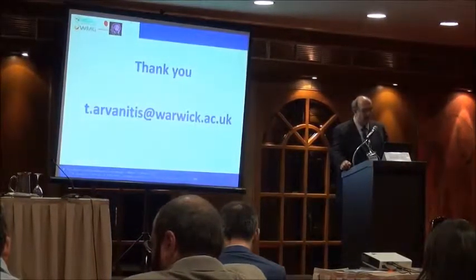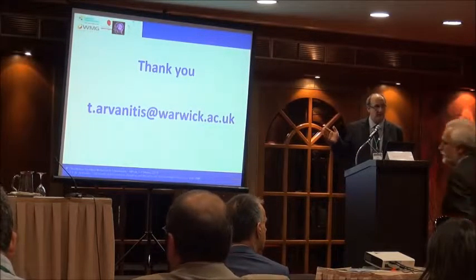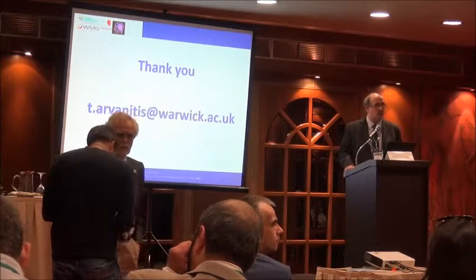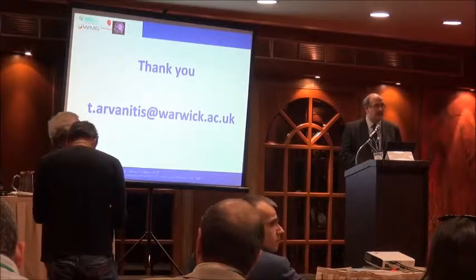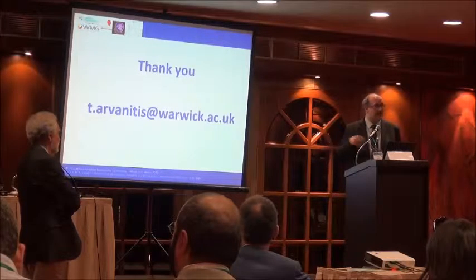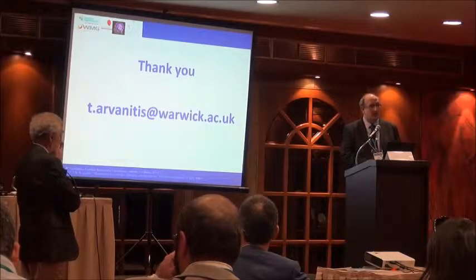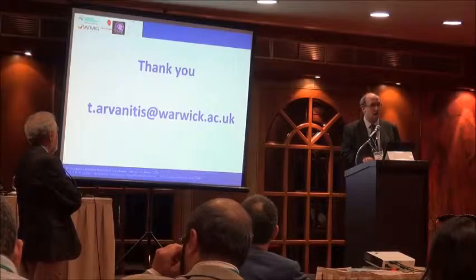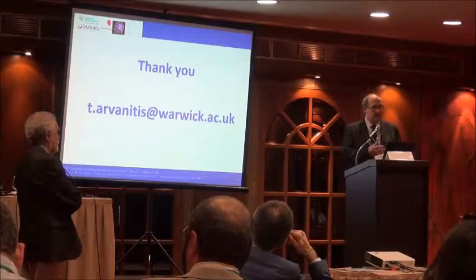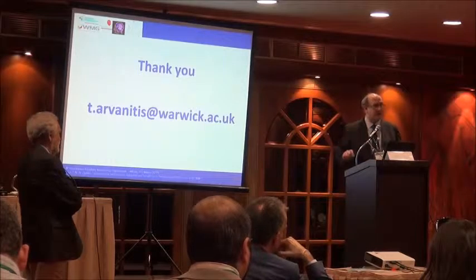multimodalities. Yes, so I haven't discussed at all what we do with quantification from the imaging side, plus any other information that comes from the genomic, proteomic, and metabolic level, which we do at the level of the lab. From the imaging side, as we have seen, we have so many modalities. So fusion can tell us more about particular specific characteristics, with quantities from metabolites and also quantities from the imaging characteristics, like perfusion measurements, diffusion measurements, relaxation measurements. If we fuse these, we can start stratifying subclasses of the tumors.